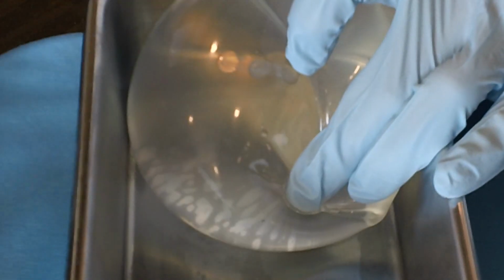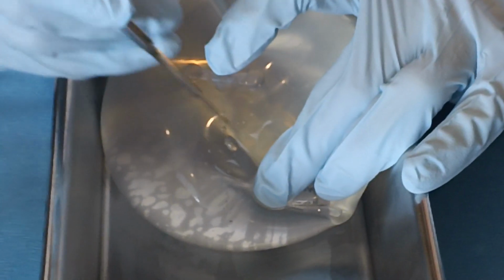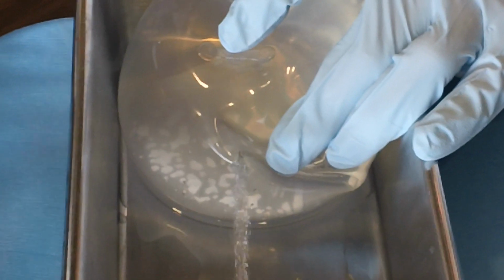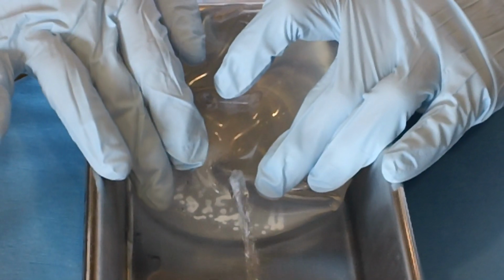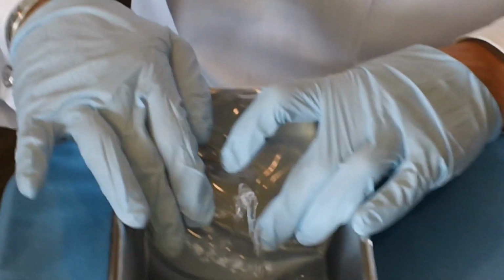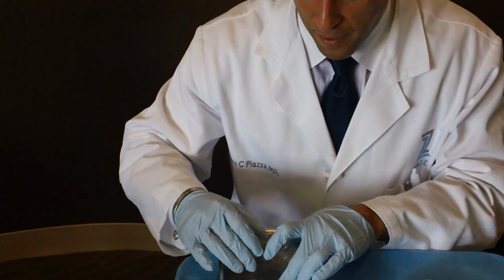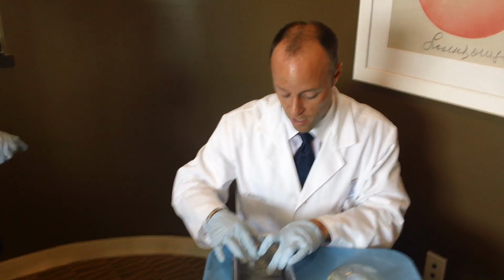Now, to speed up this process, I'm going to show you what happens when we fully have a deflated implant. I'm going to take a knife here and nick the side of this implant so you can see that's just saline fluid. This is the same thing that's in your IV, okay? So if you were to get IV fluids, whether you were sick or going to have elective surgery, typically this fluid would just be absorbed by the body. It's basically harmless, and the same thing again that we give you in your IV.